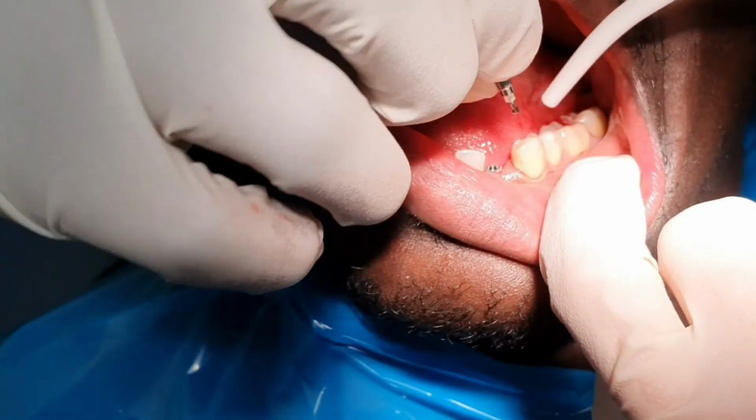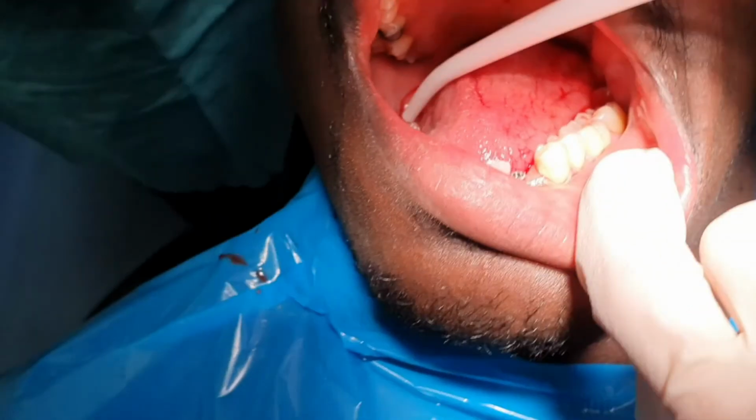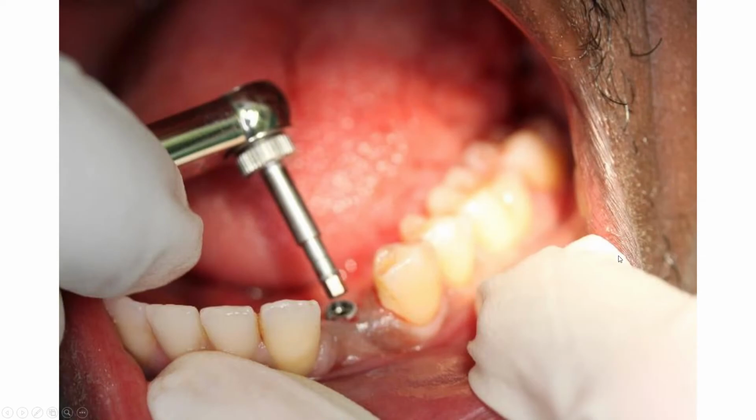The first item was an adapter that's used to carry the implant and start the procedure going. Now obviously we're not going to be leaving our implant head level with the top of the gingiva. We want to drop that head down a little bit. Now the point is, how far do you want to drop it down? Now there is a rule that I use called the 1-2-3 rule, which I'll explain to you on another presentation. But for the moment we're going to place this about 3 millimeters under the gum margin. Now you can work this out again from your scan.